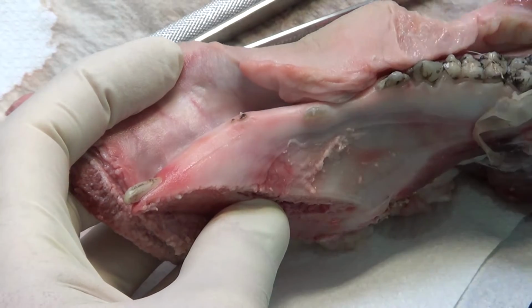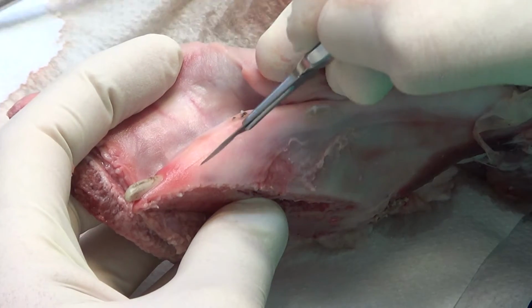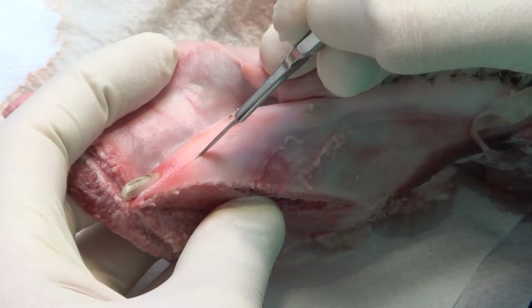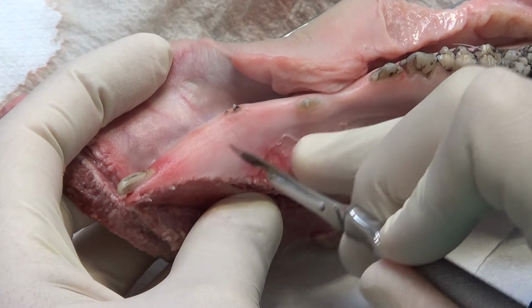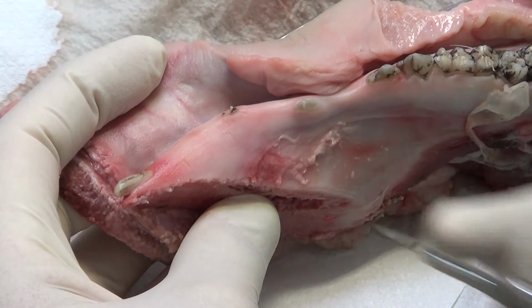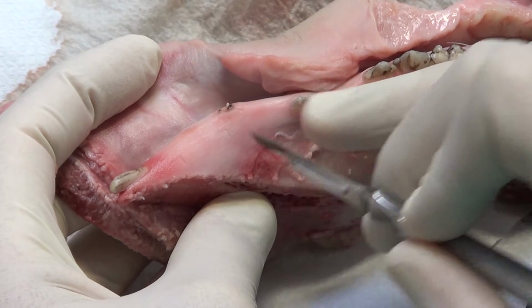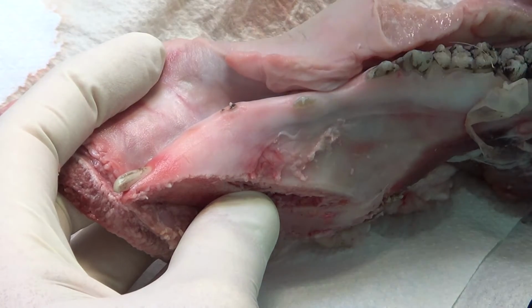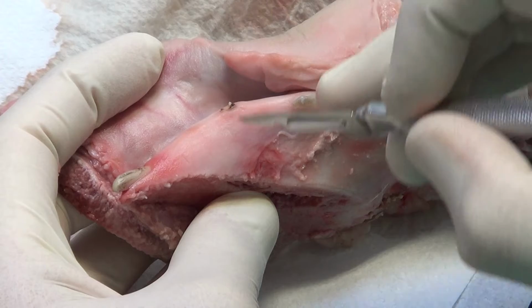Okay? And then we go with the blade. Then, when you obtain the first incision, you can do the second and the third. If you want to do that, do you prefer to do that now and then I go to the next step, or you want to see the next step and then do all alone? Let me try to do these 3 incisions.